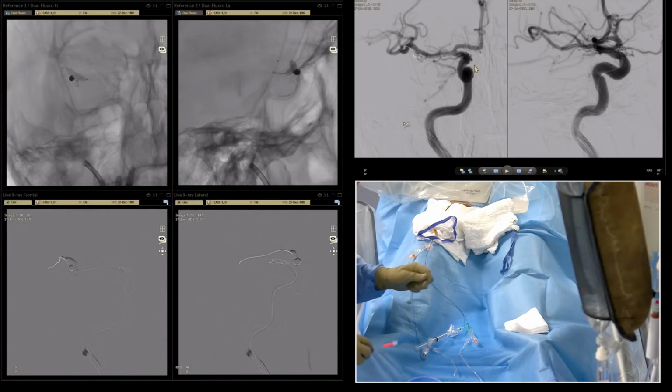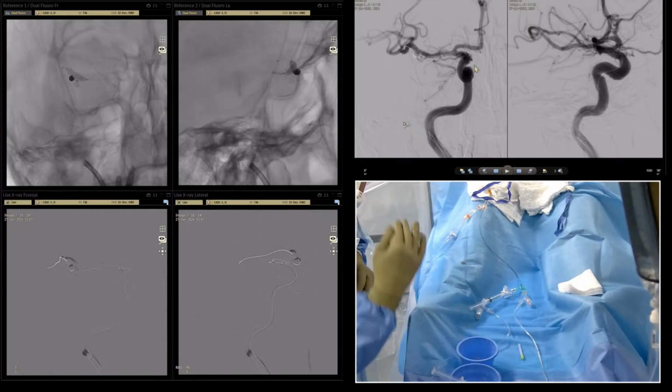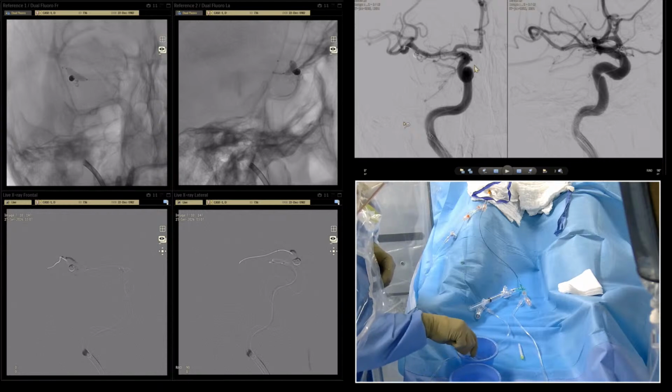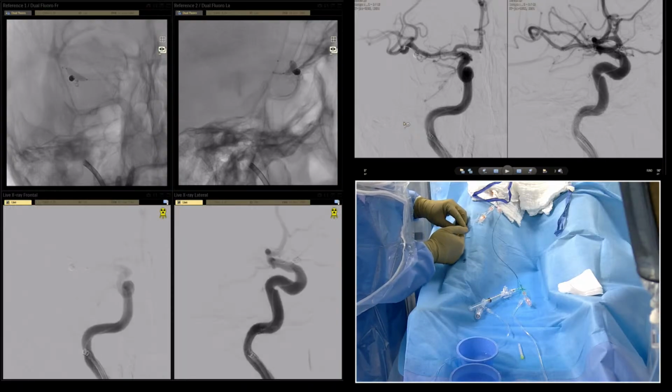I think the problem number something, it's a guide wire. We placed the guide wire and the guide wire is straight in the artery. It might be the problem. Huh? Let's check. I hope it was the place of the rupture.